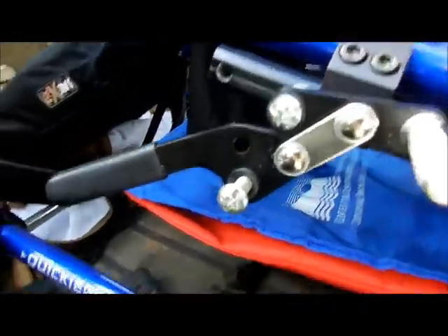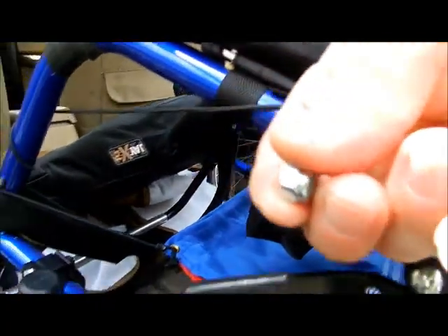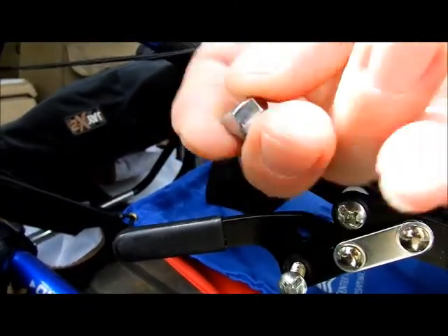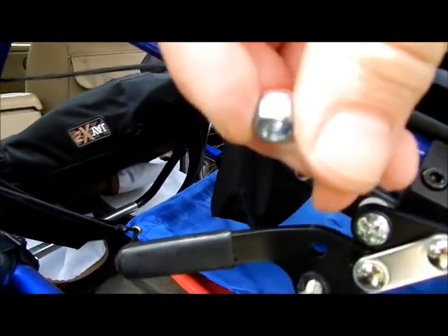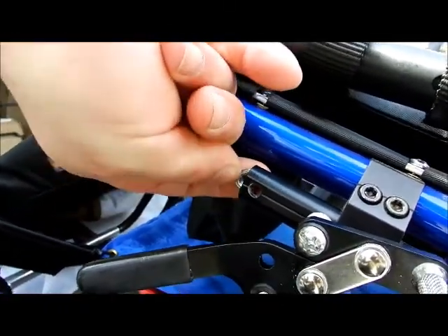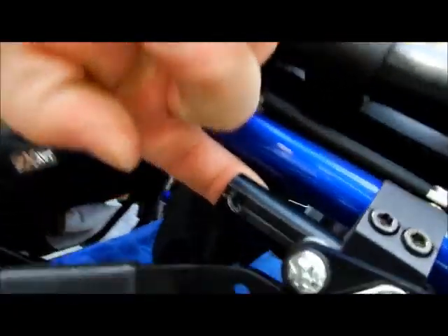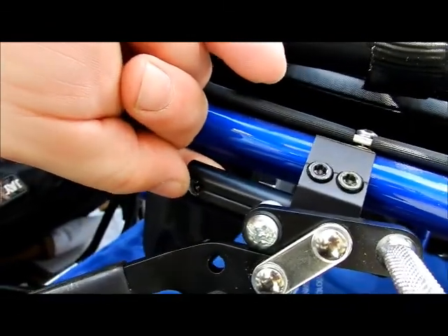Now what I did with this is I put the spacer on first — I have the spacer on the other one. Take your lock nut with the narrow part on the outside, going toward the inside of the chair, with the flat one up against the rail in there. Stick it inside to where you see the threads, and then go ahead and take that guy and screw it in.